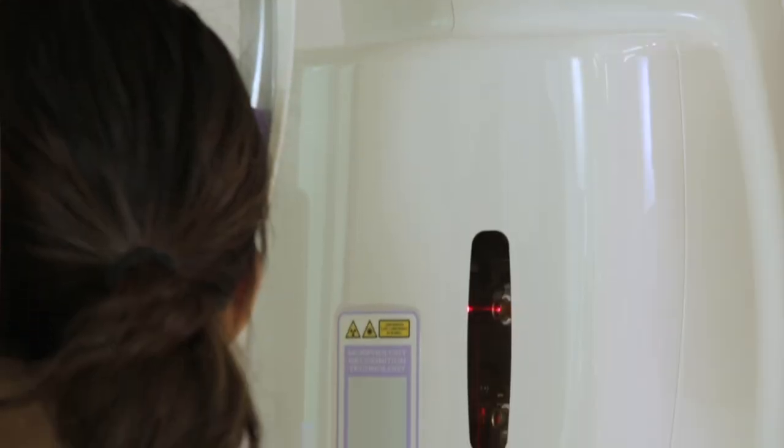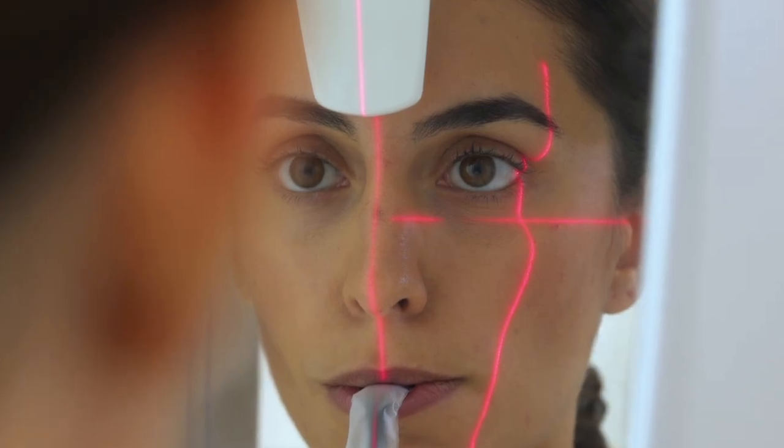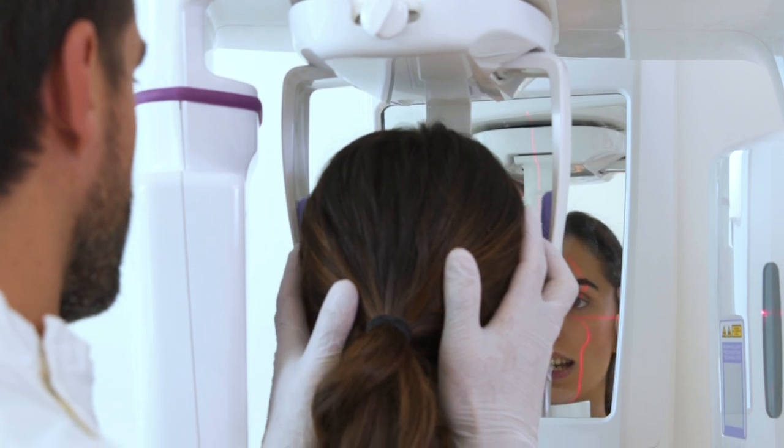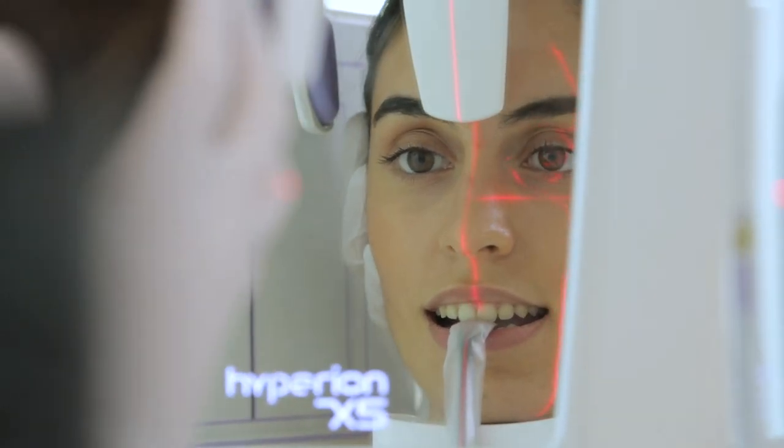To ensure maximum positioning accuracy, laser beam projections on the patient's face are needed. Looking at the mirror and watching the vertical sagittal trace, facial symmetrical positioning can be improved.